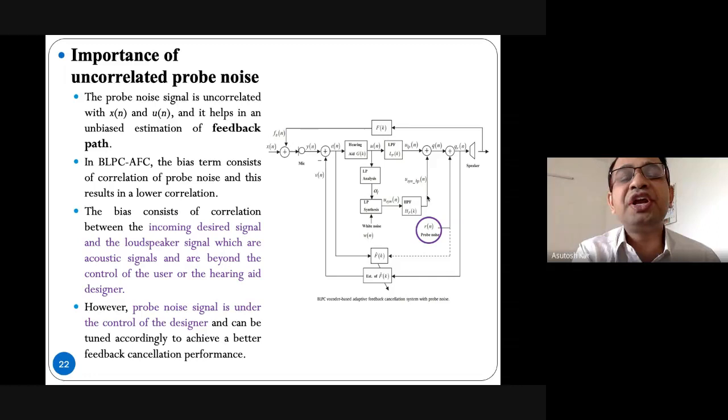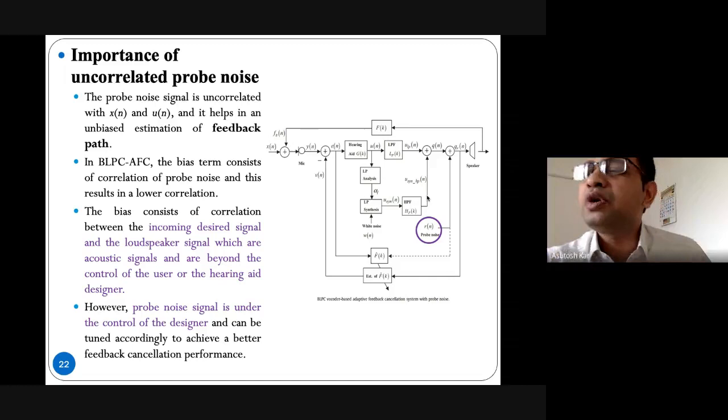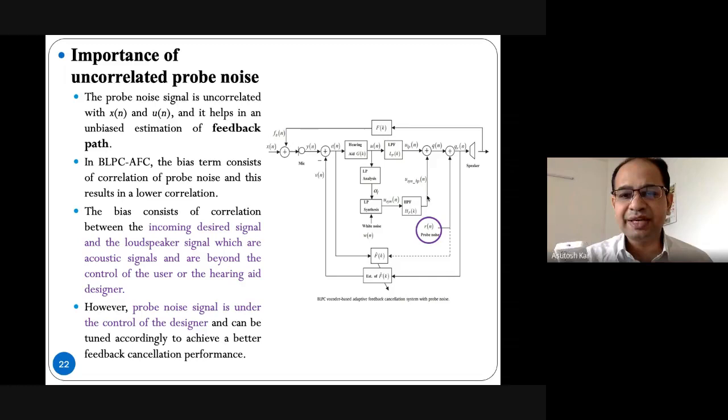I want to give a practical example. Let's say I'm talking to you. Some sound comes from another room. What I may do, using the remote, is simply increase the fan speed of my AC, or I will switch on my fan. That will not affect my conversation with you. That may keep my conversation intact.